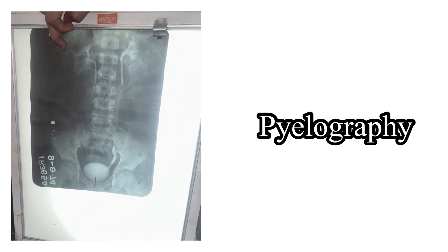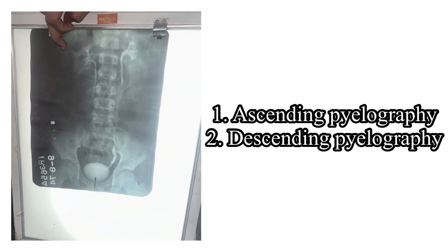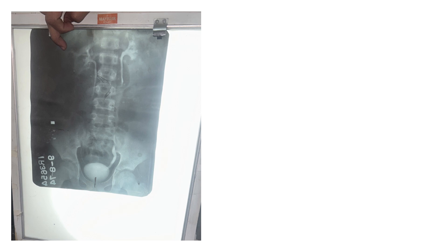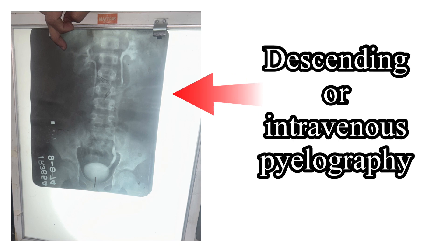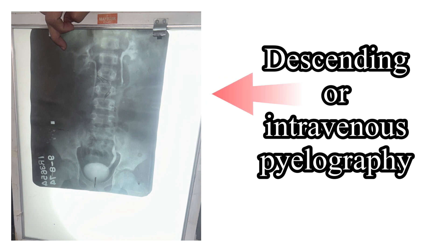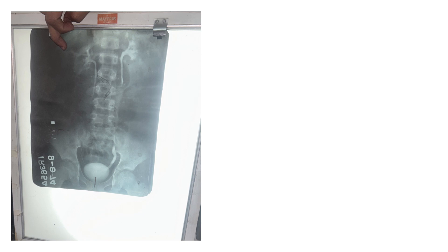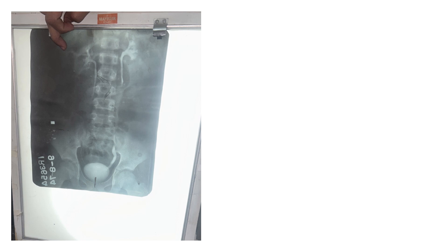Pyelography is done to examine the urinary tract, and the radiograph obtained is known as a pyelogram. Pyelography may be of two types: descending or intravenous pyelography, and ascending pyelography, also known as retrograde pyelography. The X-ray seen here is that of descending pyelography, also known as intravenous pyelography, because the radio-opaque dye is injected intravenously. The course of the ureter is clearly seen up to the urinary bladder, which appears oval or triangular in shape.